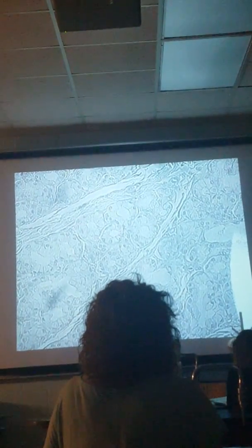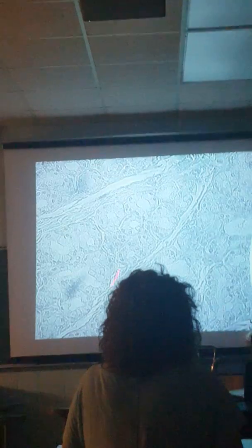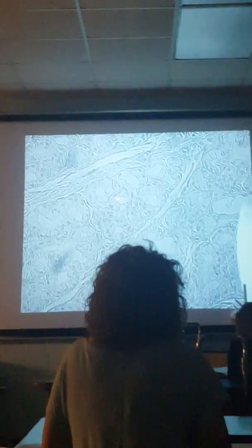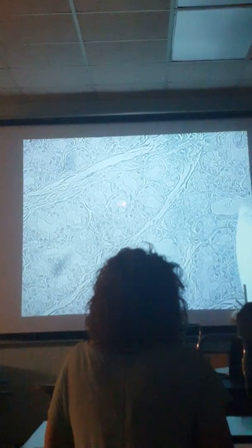They have an acinar formation in that they're all grouped around, like slices of pizza, and then they secrete bicarb into this duct, which eventually ends up inside the duodenum. So you have a ring of cells around a central duct. I see a bunch of them all grouped together.